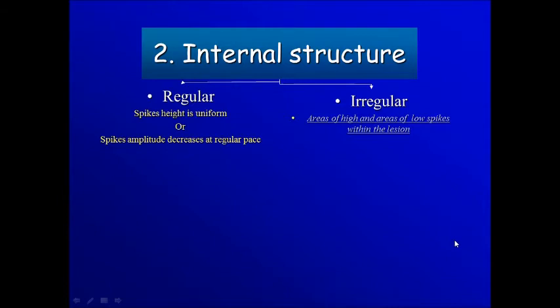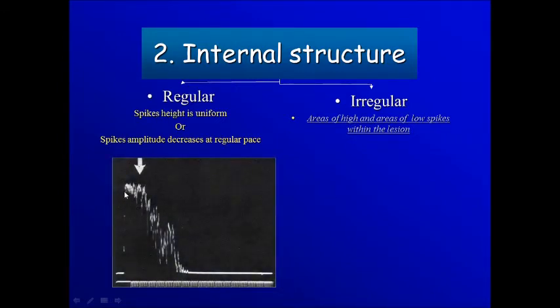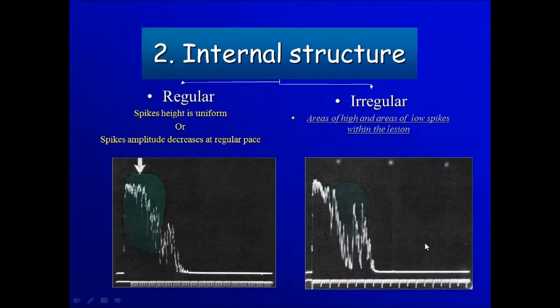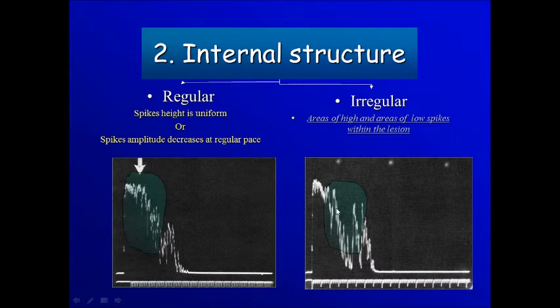The second thing is the internal structure. The internal structure of a mass can be regular or irregular. A regular internal structure means that within the lesion area, the amplitude is at a uniform level or gradually slowly decreases. An irregular internal structure means that the reflectivity can be high, then low, then high, then low — alternating areas of high and low reflectivity, giving high spikes and low spikes.